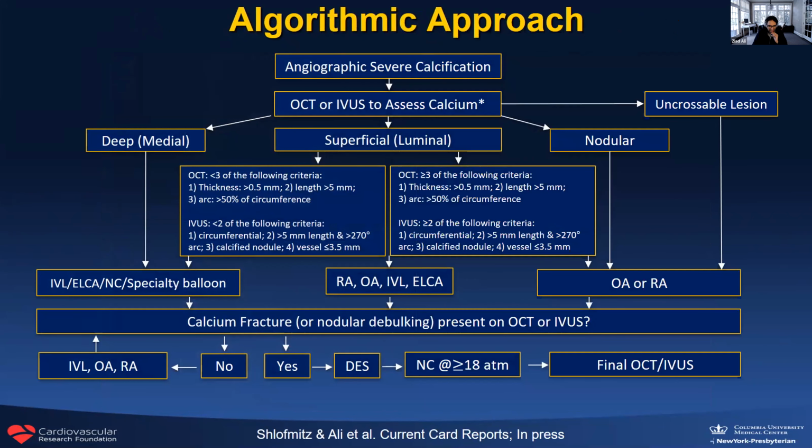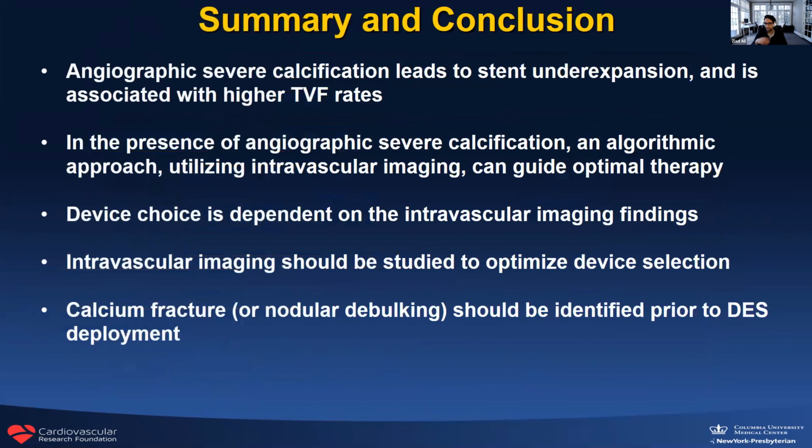Thus, I would strongly suggest that we consider to use an algorithmic approach using advanced OCT imaging for advanced calcium lesion preparation.